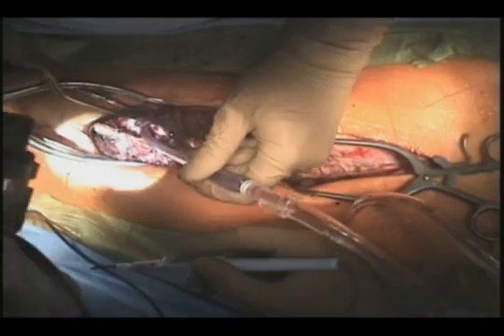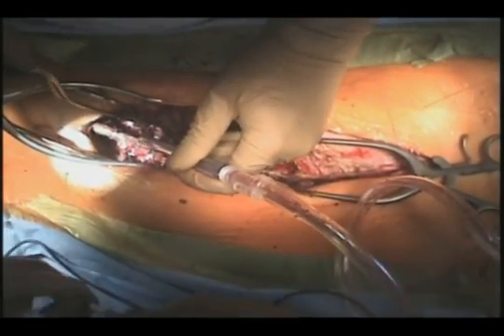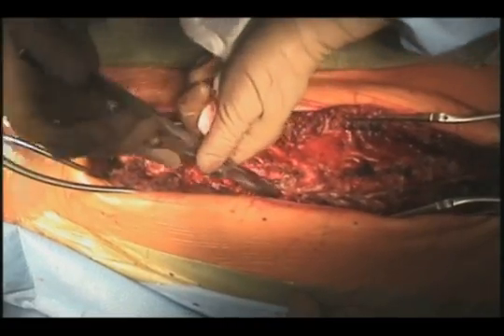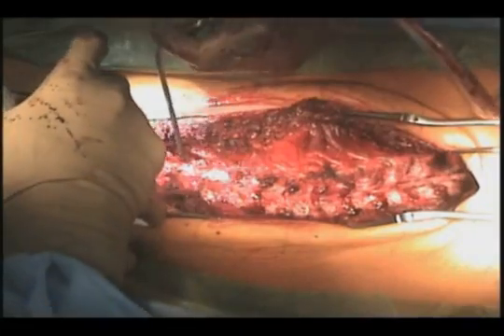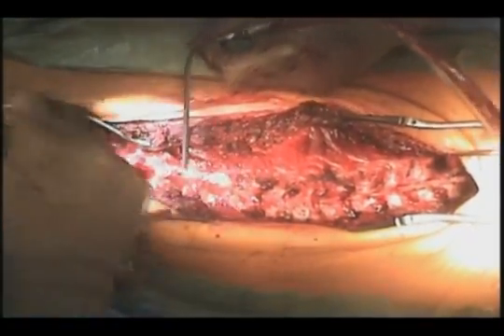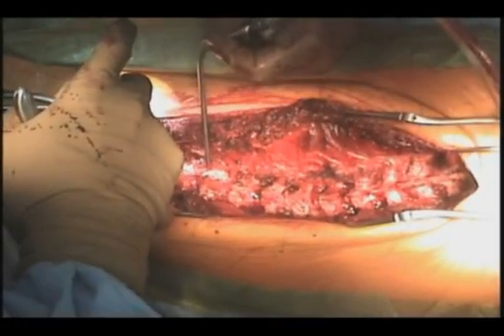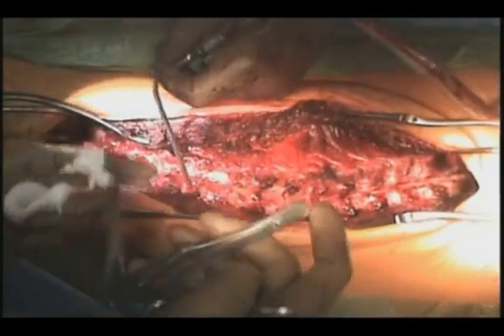A subperiosteal dissection of the spine is performed, exposing the transverse processes, the facet joints, and the midline ligamentous structures. The interspinous ligaments are removed with a Leksell rongeur as shown here. And then at each segment, facetectomies are performed, which have already been done, and now I'm performing Ponte osteotomies, in which the intersegmental resection of the ligamentum flavum and the superior articular facets are removed.